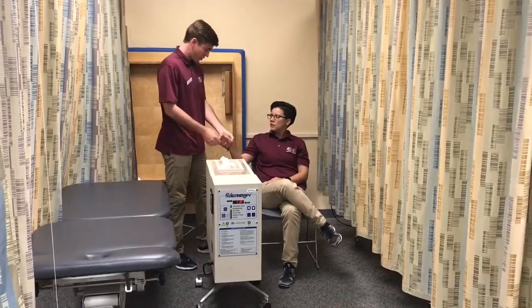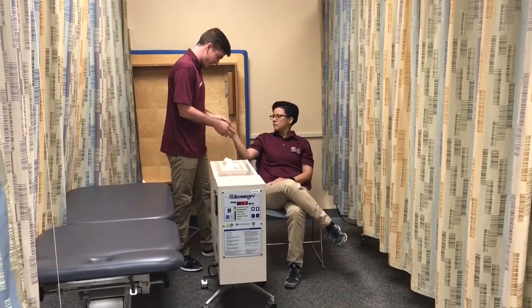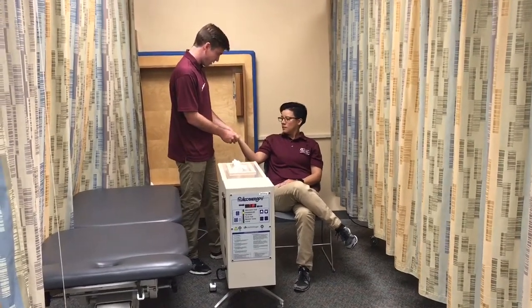I know you washed your hands before we got here, and now we're going to assess the hand for any open wounds and for sensation. You feel this? Feels good? Alright.